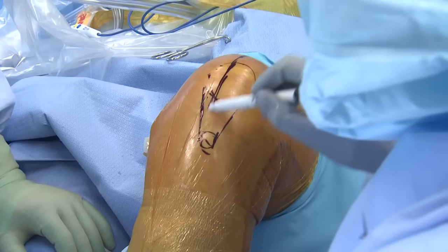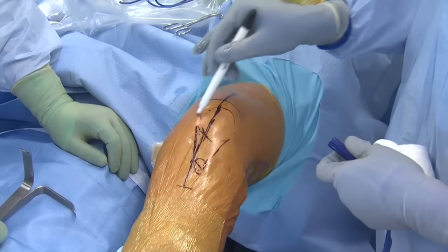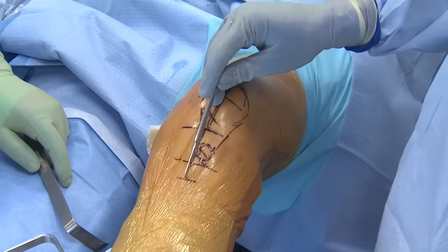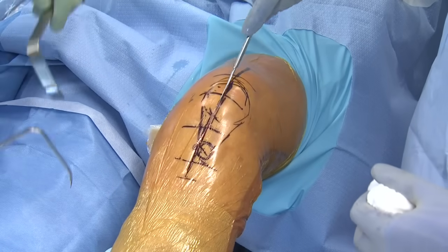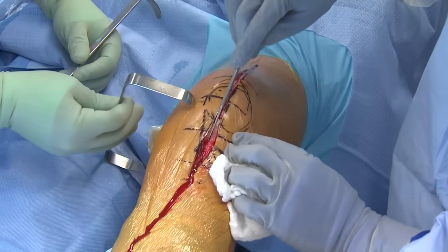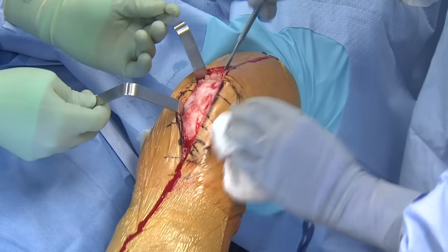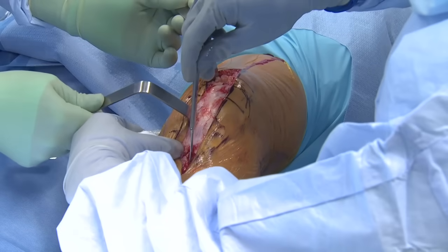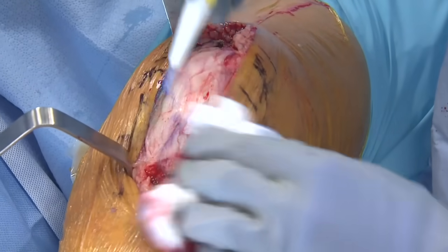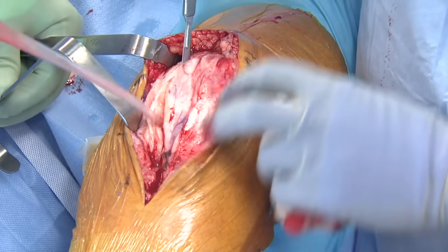The knee is identified and surgical landmarks and incisions are outlined. Incision is made along the medial aspect of the knee. Retractors are used to allow visualization and mobilization of soft tissues. Cautery is utilized for superficial hemostasis.